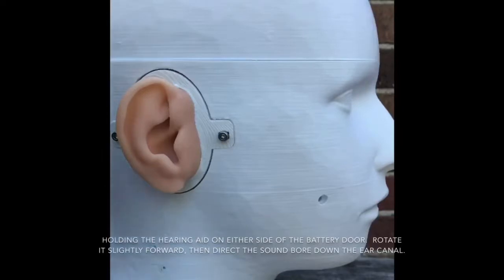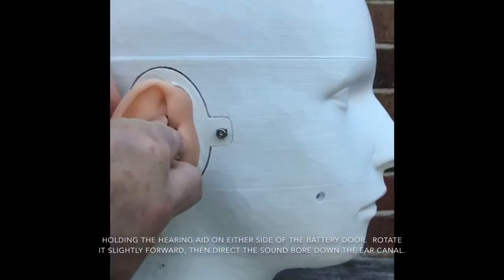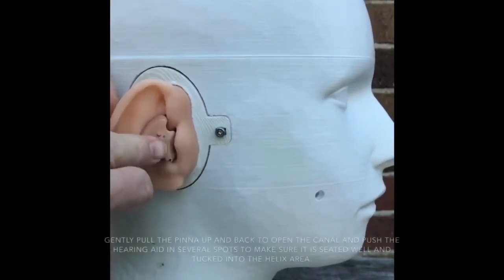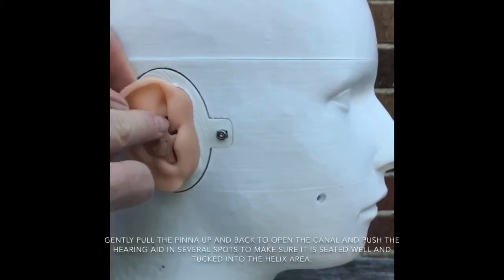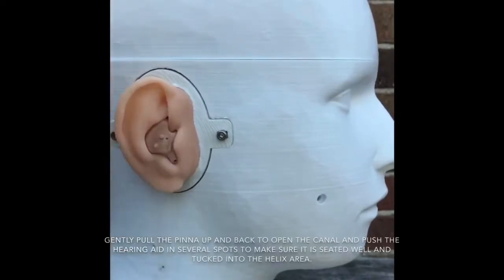Hold the hearing aid on either side of the battery door. Rotate it slightly forward, then direct the sound bore down the ear canal. Gently pull the pinna up and back to open the canal and push the hearing aid in several spots to make sure it is seated well and tucked into the helix area.